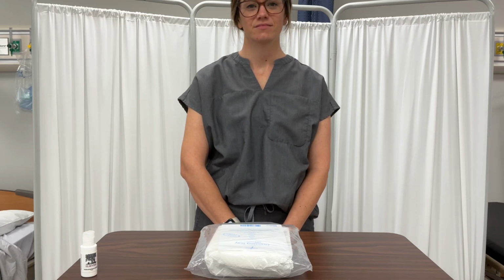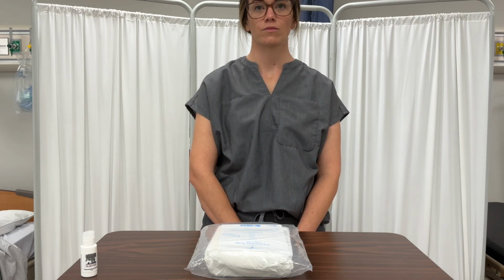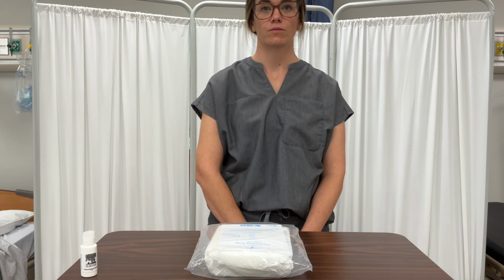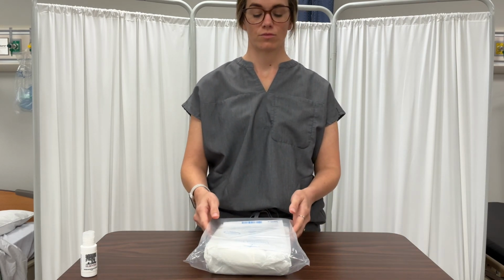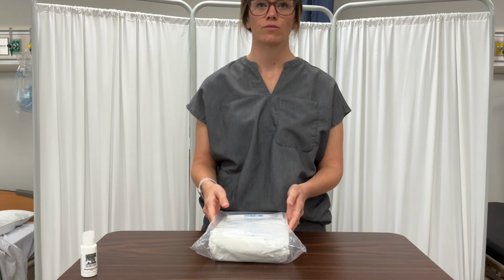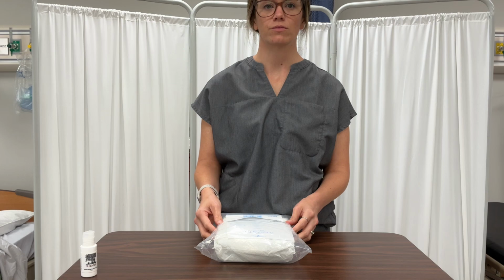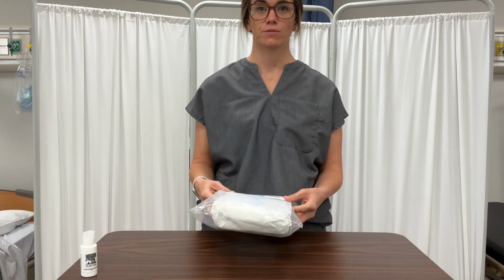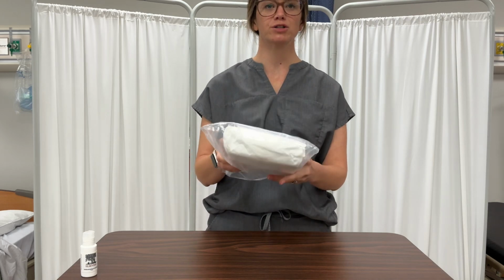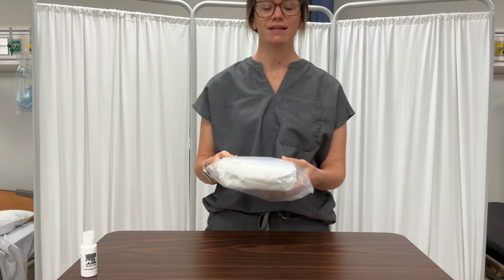Now we're going to go over the sterile field skill with you. You have a couple of different checkoffs for this. The first one is the opening of a sterile package on a surface. Always remember that you need to verify the procedure requires the surgical aseptic technique. You're going to look for latex allergies, and you're always going to check the package. Make sure that there are no punctures, make sure it is sterile, and also make sure it is not expired.